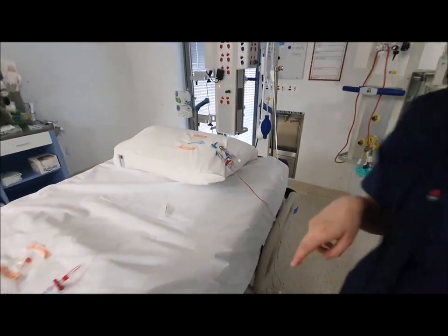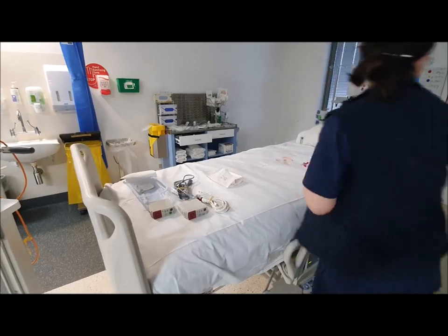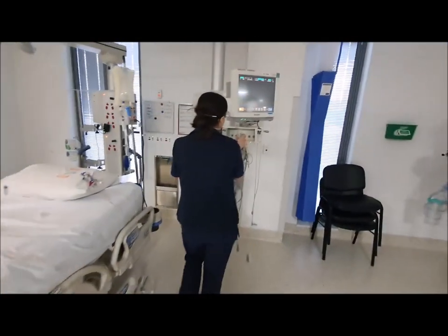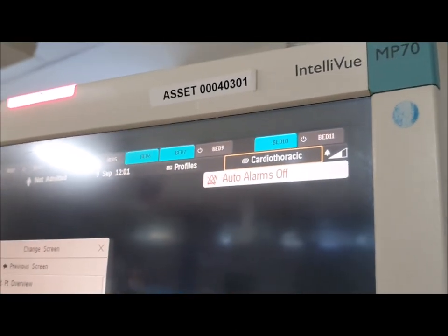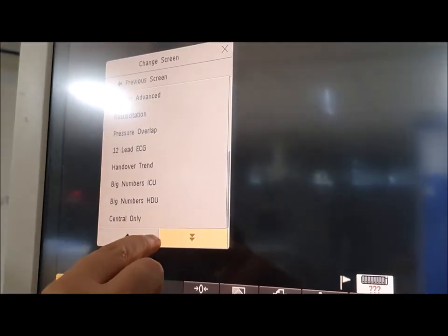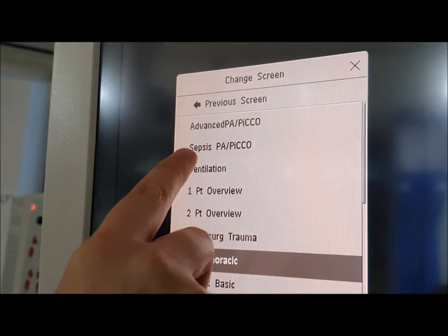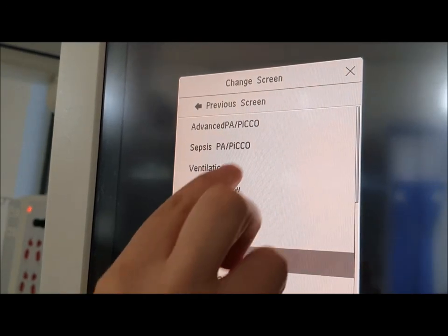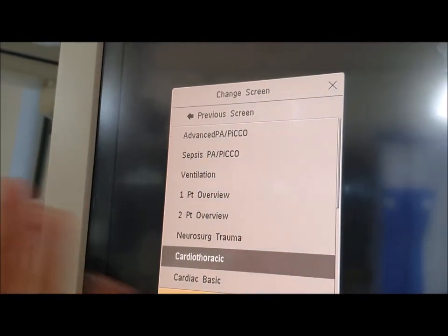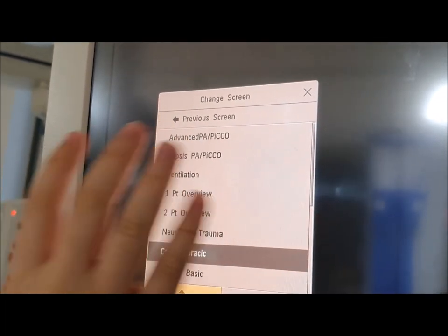Then we've got our pressure monitoring modules and our cardiac output study module. I'm going to put all three in. See how it's labelled cardiothoracic — I'm going to click on it and select the one that says Pico. You'll see that there are two that say Pico: you can do Sepsis PA/Pico or Advanced PA/Pico. It doesn't really matter generally speaking which one you choose.